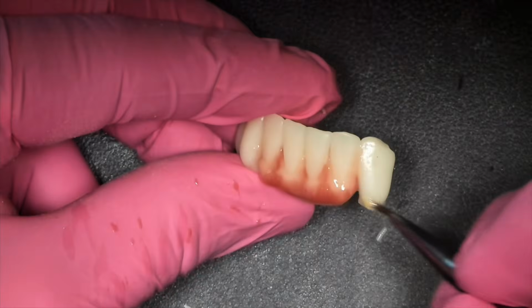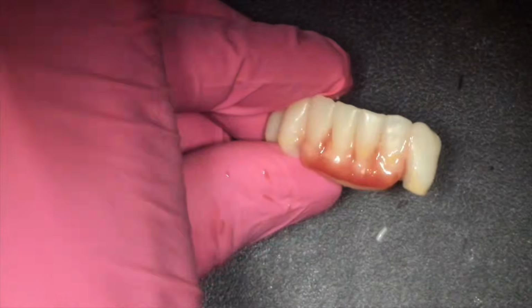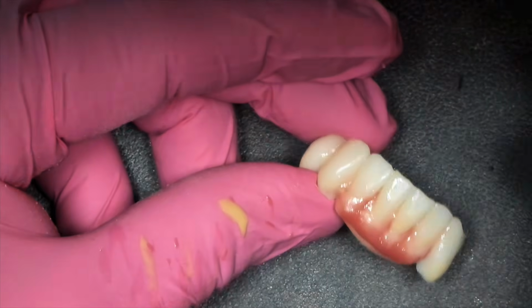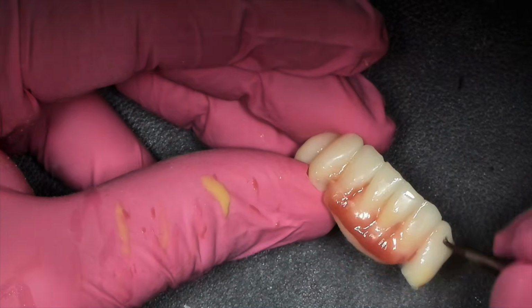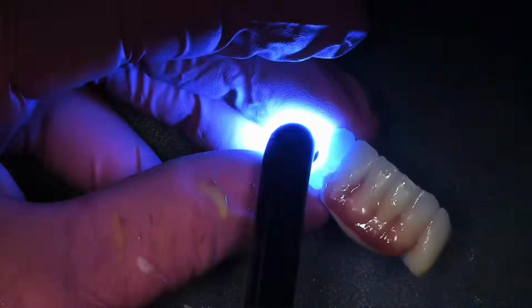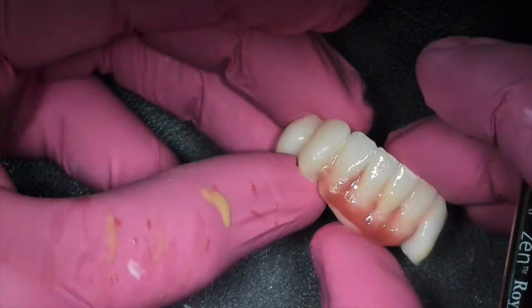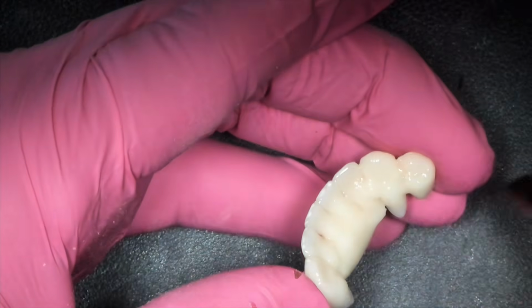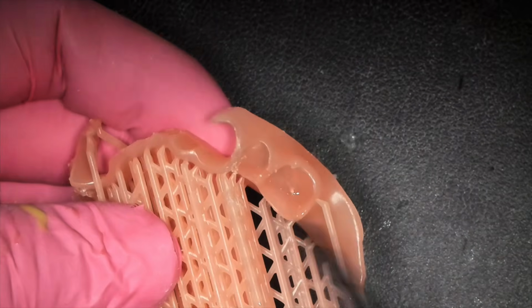Okay, so now I'm going to go ahead and finish the teeth. I'm putting some cervical brown on his, just to make it look a little bit more like natural teeth on the lower instead of artificial teeth, with some translucency on the incisal edge, like some translucent gray, and some white on the very, very incisal edge. Then I'm painting it and covering it with a glaze. In this case, I'm using a glaze that's also unreleased on the market, and I'm going to cure that. And while that's curing, I'm going to finish my partial denture.